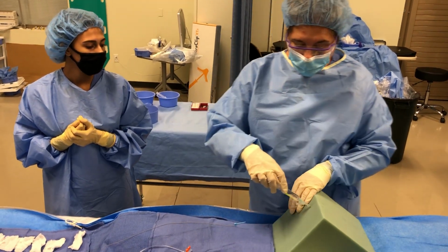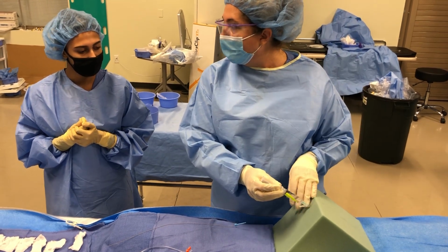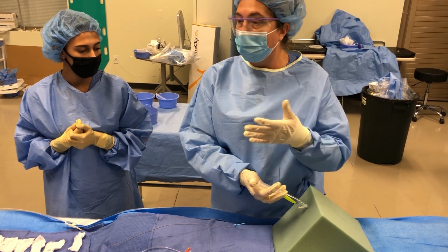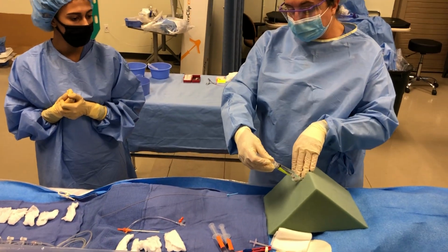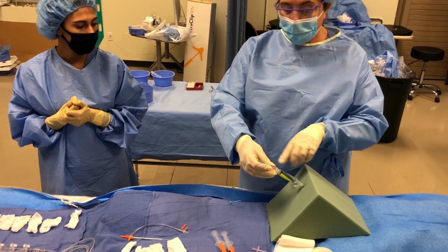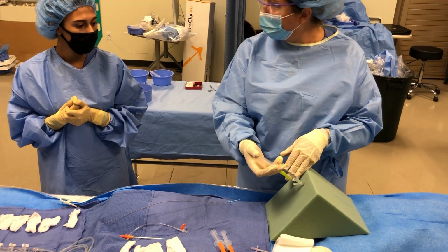The reason they need to aspirate is they could be in the artery or the vein with that needle. And we don't want to just start injecting lidocaine into their bloodstream because it can cause arrhythmias and can cause problems, okay? So they're going to go in, they're going to pull back on this plunger a little, called aspirating. If they get no blood return, they're in the tissue. Then they can start injecting.